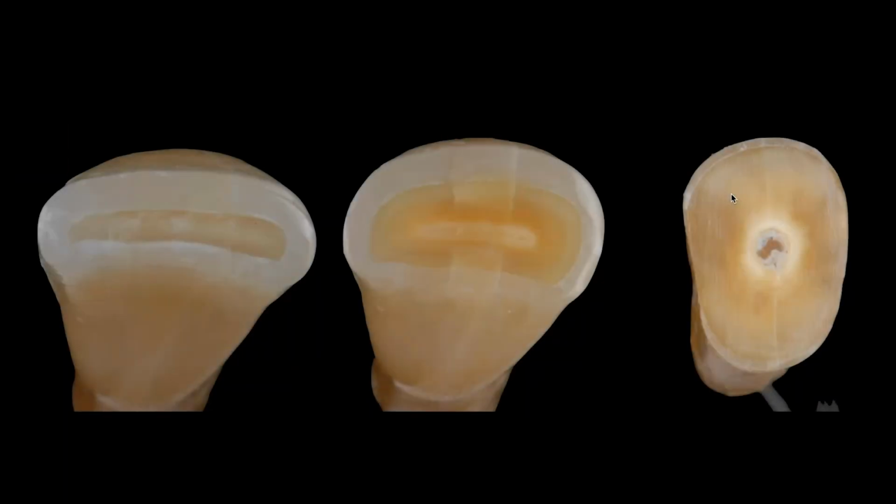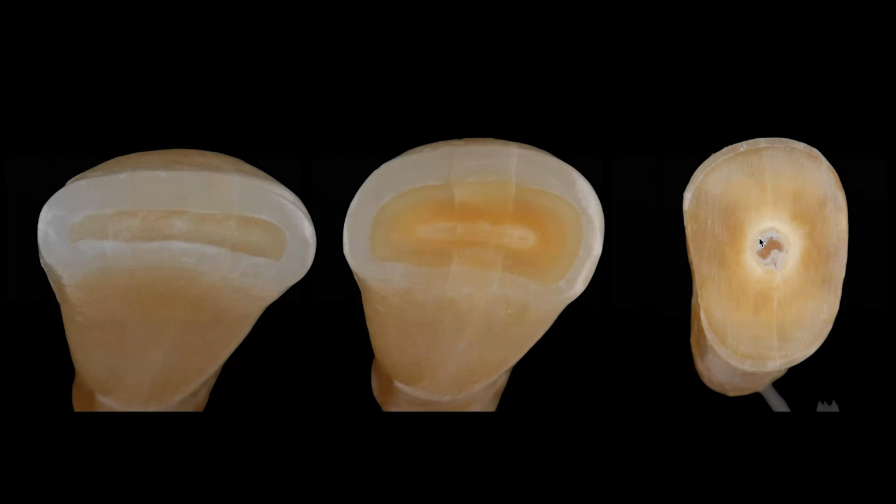And I've used this example before. A lateral with a worn incisal edge. Here's that same lateral cut off 2 millimeters down, and here's that same lateral cut off to the root. Look at how much different that form and that contour is that we have to kind of work our way through.